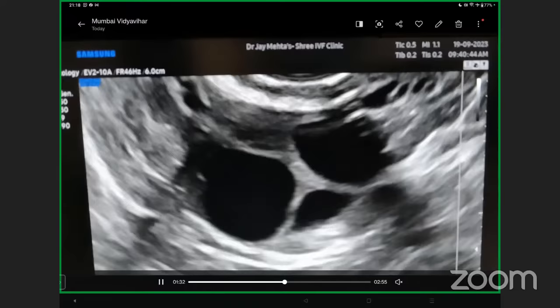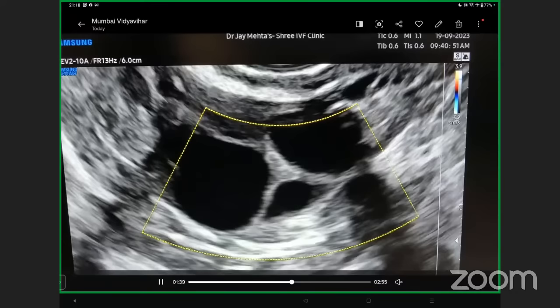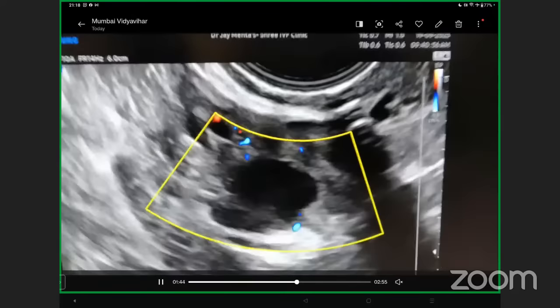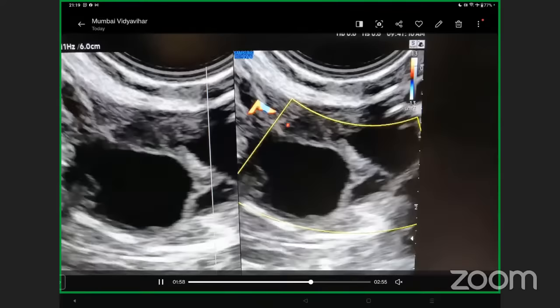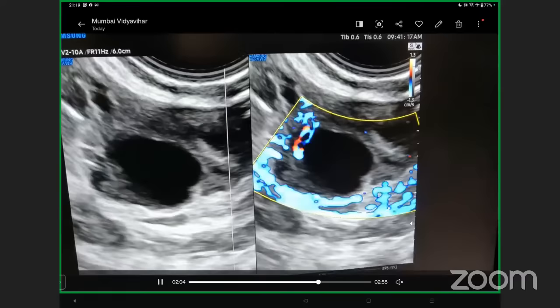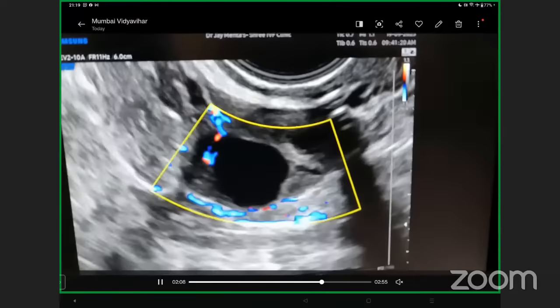At this stage — day 6 and day 7 — taking two or three measurements doesn't really matter. One reading is 13 mm, second is 12 mm, third is 13 mm again. Will you consider this 12 or 13? It doesn't matter, because the minute it crosses 10–11 mm and touches 12 mm, you are supposed to add antagonist in your fixed protocol.